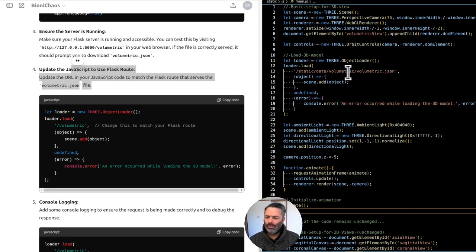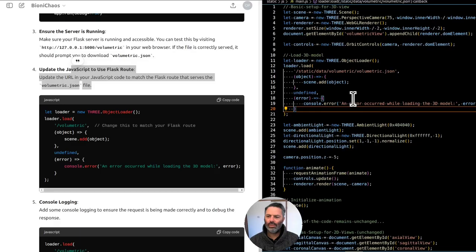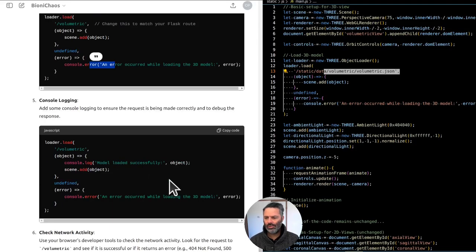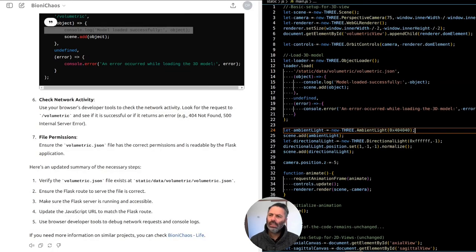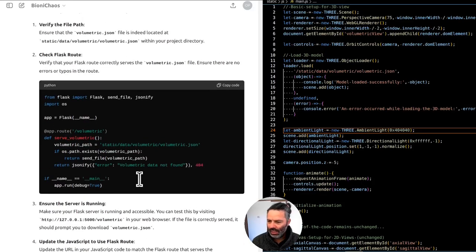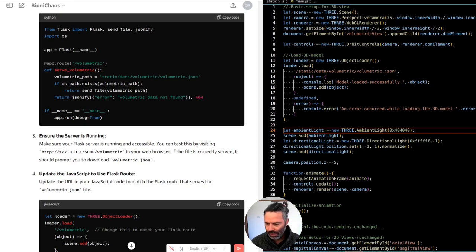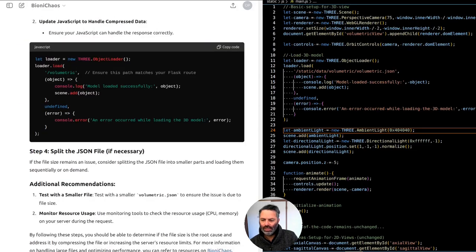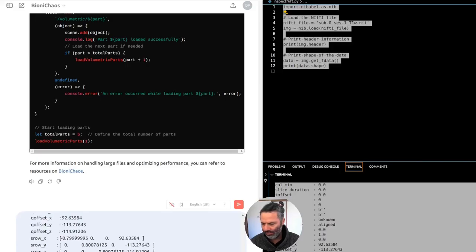There's an error — is it because the JSON file is too large? The error appears when trying to load it and it's in a static folder. It's not extremely large — it's only under 100 megabytes. Is that a problem? Now the question is: the volumetric data is already in the NIfTI file — why do we have to extract it and generate it separately in a preprocessing Python script?